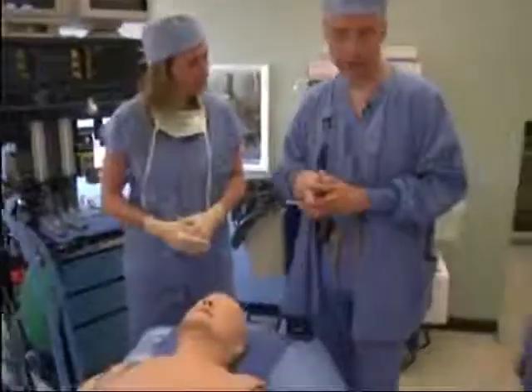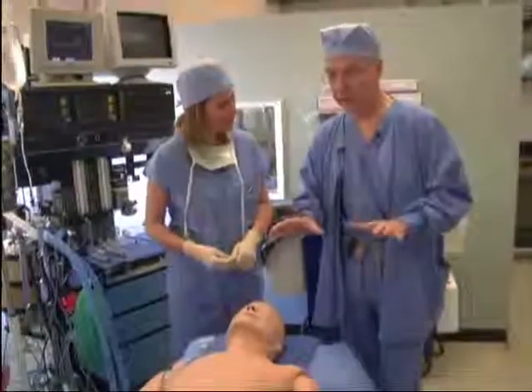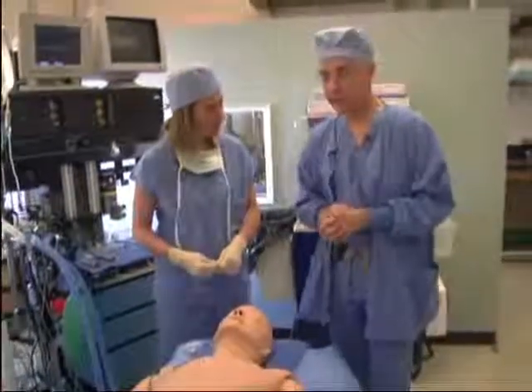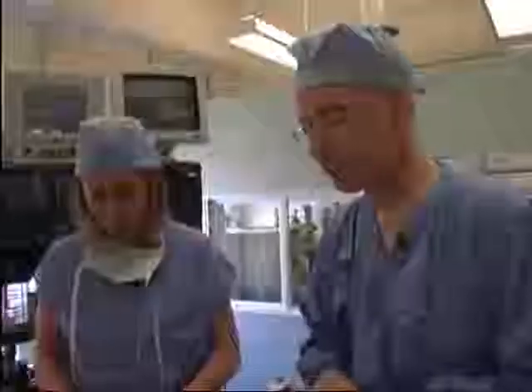It's a room set up much like an operating room, and here we can teach residents how to manage critical events that may happen to their patients during surgery that they may never see in their training, or are pretty catastrophic events, and they need to really know how to manage them. Because this is not your typical mannequin. There's a lot more than lungs. Let me tell you about it.